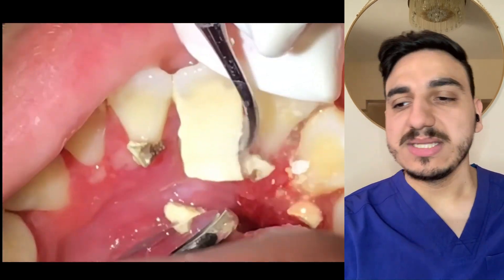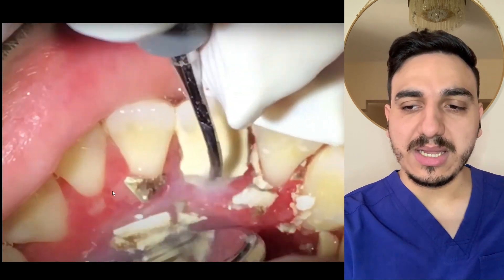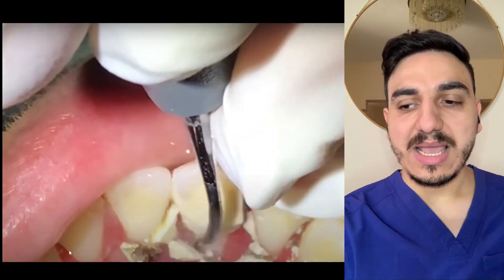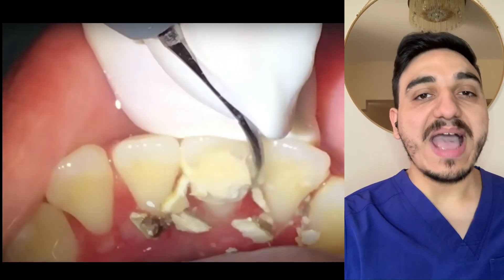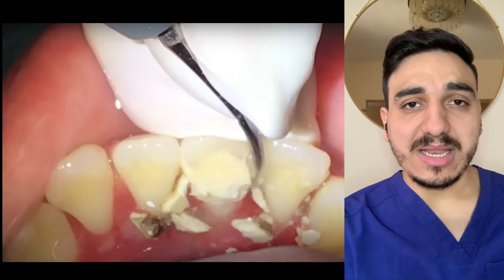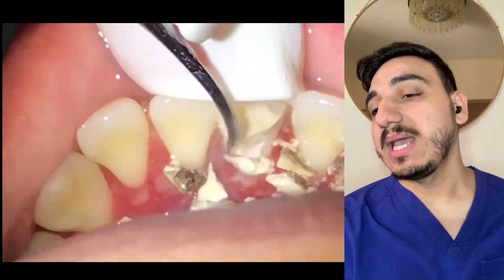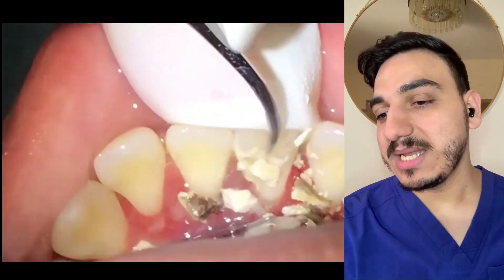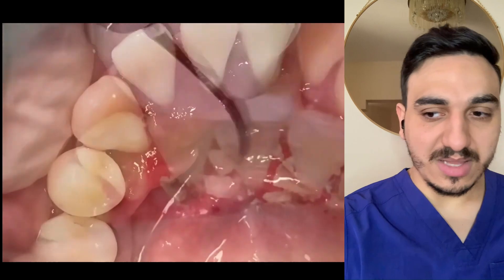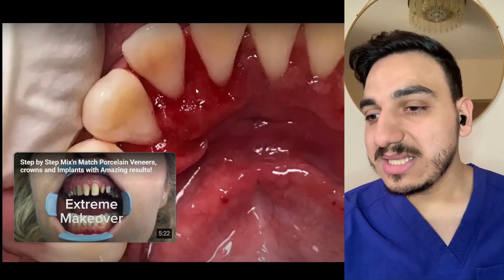As you can see, although the operator did clean that other side, the bleeding slowly stops. Because we have a typical bleeding time — for a lot of people it varies, but it's a few minutes — and at some point the bleeding will stop. It's not like the whole thing will continue bleeding.